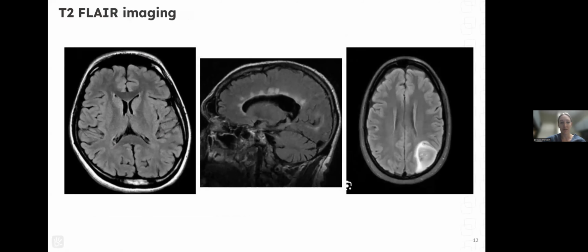And then this is our FLAIR image. So now we have that same axial cut. You suppress or attenuate that fluid in the CSF spaces, and now it's dark. And so then you are able to visualize those abnormalities that may be closer to the ventricles. Specifically here, in the middle, these are called Dawson's fingers. As some of you may recognize, this is a common sign in MS, and it's hyper-intense, seen on T2. So by being able to suppress that CSF signal from the T2 images, you really get a better visualization of that demyelination close to the ventricle.